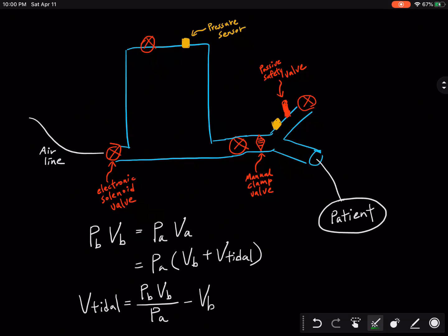This is a diagram of the basic design for the Windkessel modulated ventilator. It has a rigid Windkessel chamber with a volume of about 1.4 gallon. It has 4 electronically controlled solenoid valves. It has 2 pressure sensors, 1 passive safety valve to prevent overpressure to the patient, and a manual clamp valve to regulate the rate of flow in this channel.